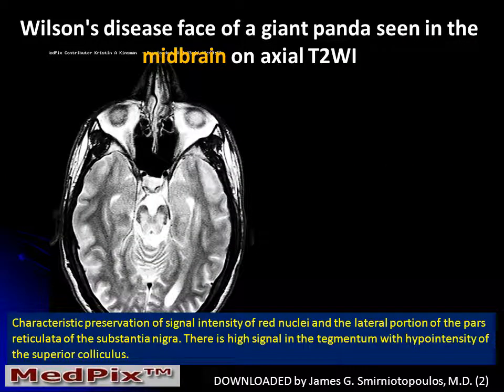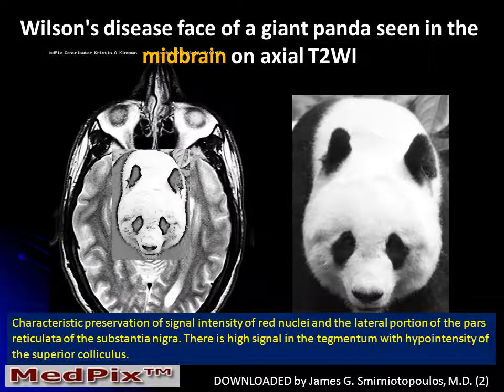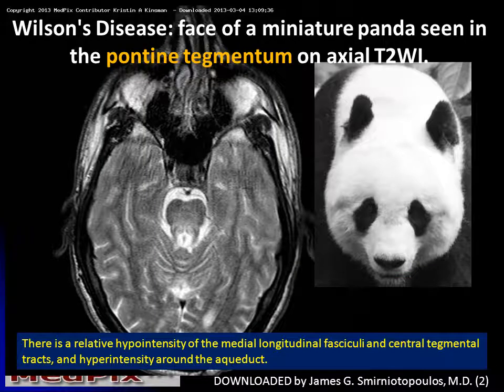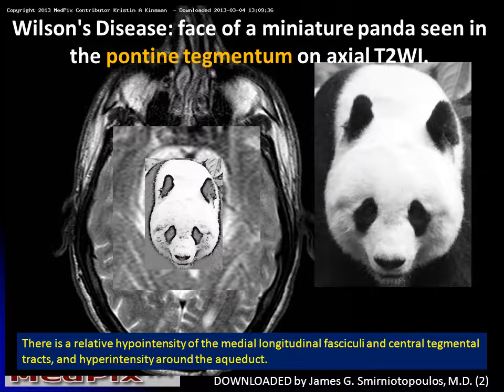Wilson's disease is also known for having what is called the giant panda sign seen in the midbrain on axial T2-weighted images. This is formed by the normal low signal intensity of the white matter of the cerebral peduncles, the normal low signal intensity of the red nucleus, and abnormal hyperintensity involving the remainder of the brain stem. We sometimes talk about the small panda sign involving the pontine tegmentum, with a pattern of abnormal hyperintensity involving the brain stem in the region around the cerebral aqueduct.